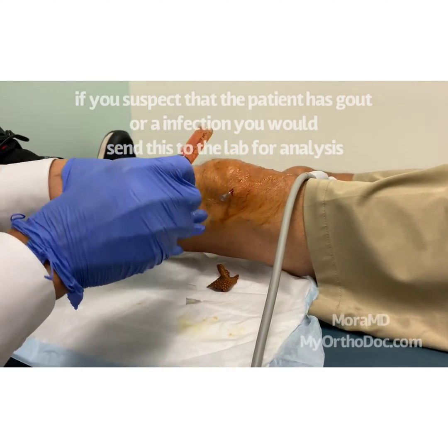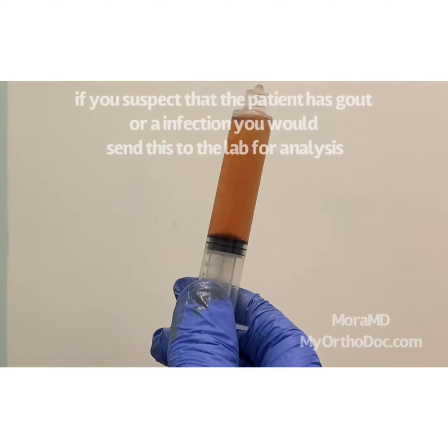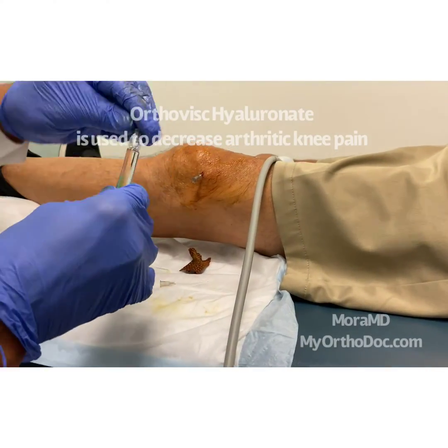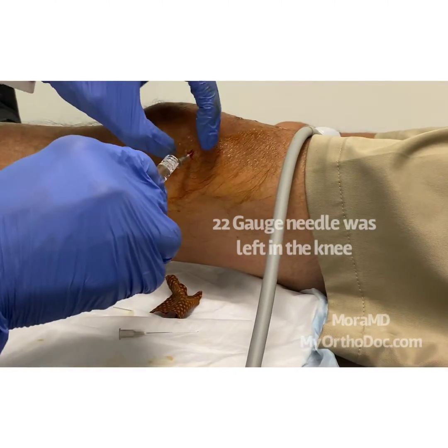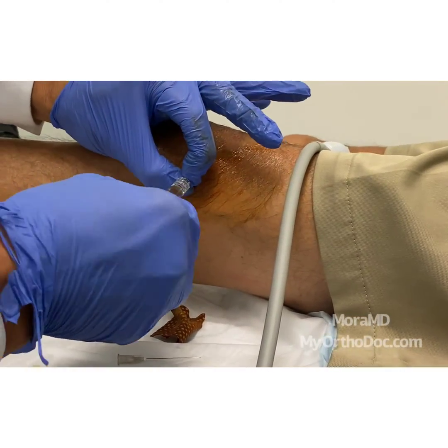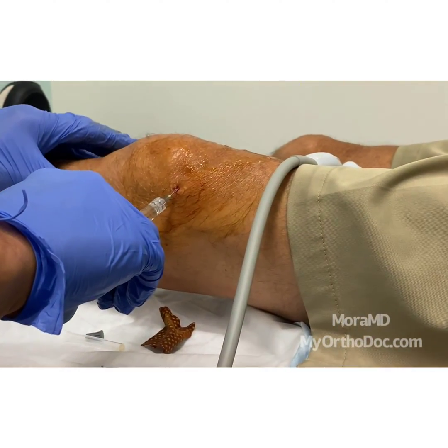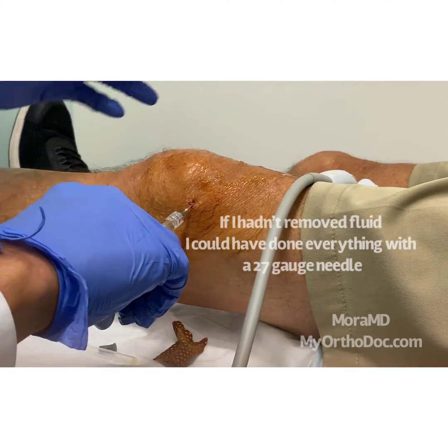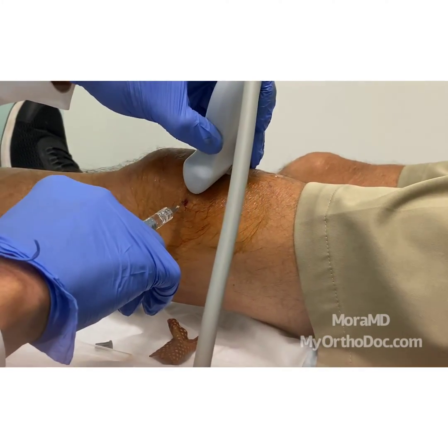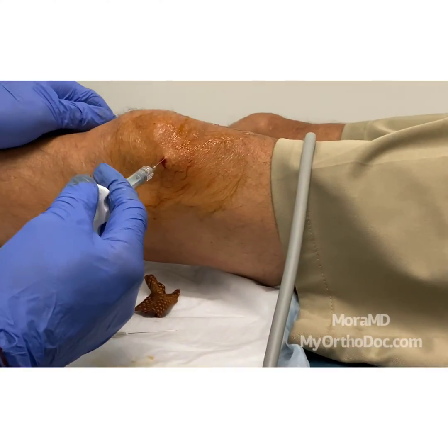It looks very normal — that looks very normal. The Orthovisc — once again, I haven't really exposed the joint to anything else, I have not exposed the joint to any other needles in and out. So now I just inject, and let me just make sure once again the needle is right where we wanted it to be, right in the joint space. And that's why it's good — I come out.